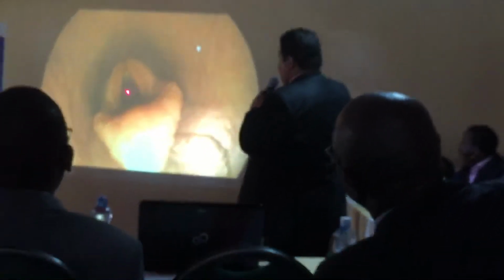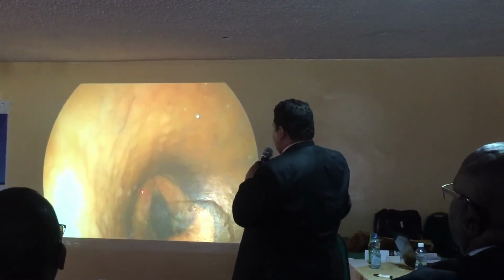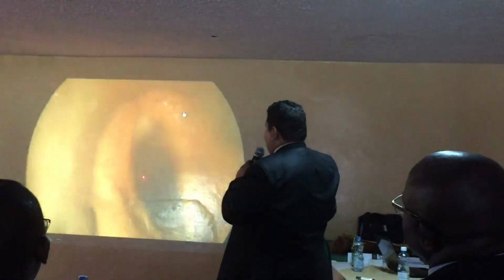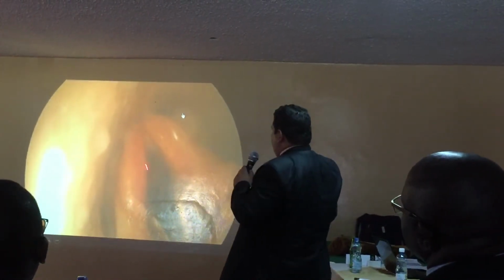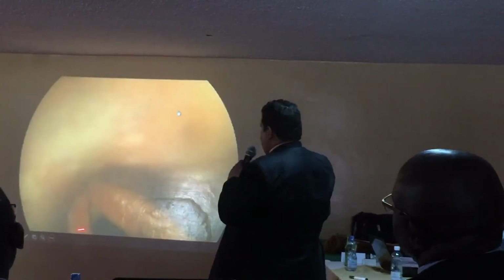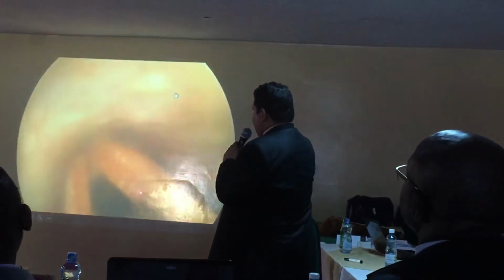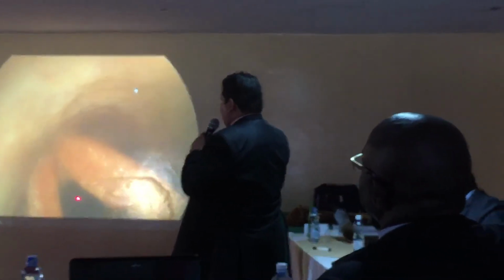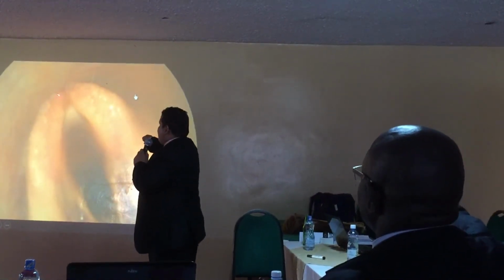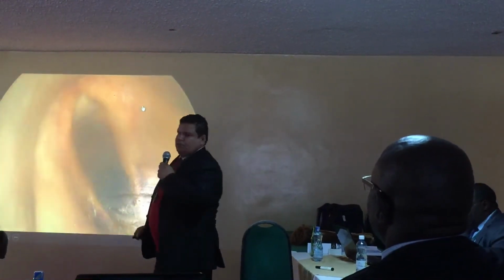During breathing in a healthy animal, this is the epiglottis with blood vessels. The entrance, and deglutition now. This is the corniculate process, vocal fold. This is of the live animal. This is the entrance of the upper respiratory tract. Then up, this is the entrance of the digestive system in the equine.